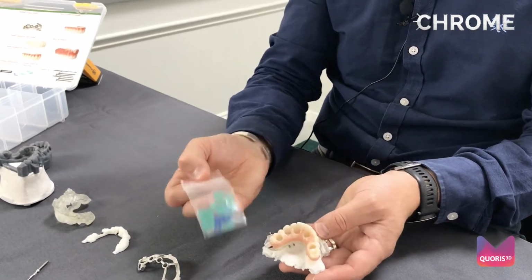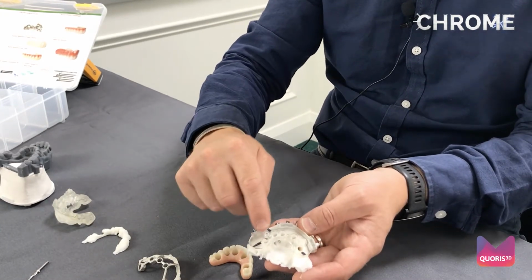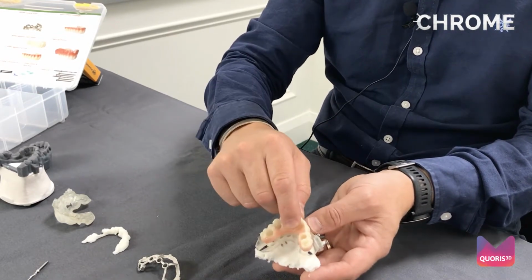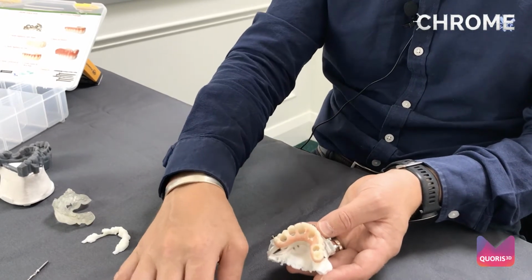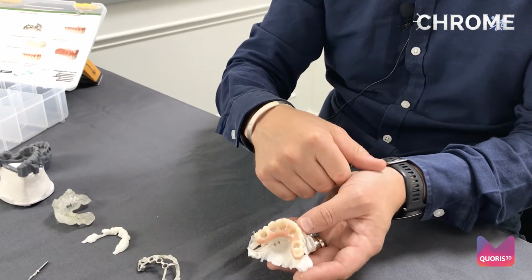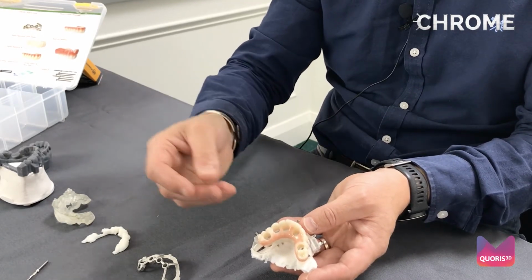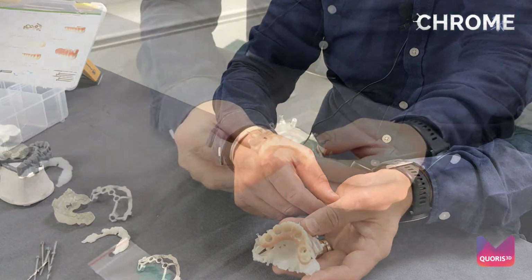You use the gaskets, so you would then remove your provisional, place the gaskets over the top of your temporary cylinders, as you can see on the photograph, replace your provisional bridge, place the blue blockouts inside the top of the temporary cylinders. Again, you can see this on the photograph, and using the Voco material, Voco Quick Up, you can then simply inject and pick up your bridge.